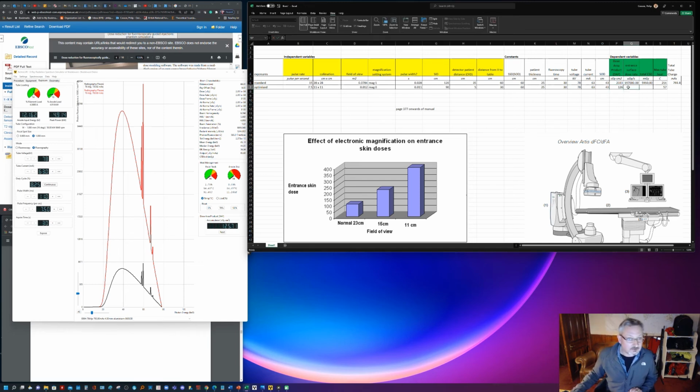The microgray was 2.3 times 10 to the 4, so that equals 2.351 times 10,000 this time, instead of 100,000. And the milligray, if I bring that same calculation down, it gives us 705. So significant drops. And mAs, 156 mAs.